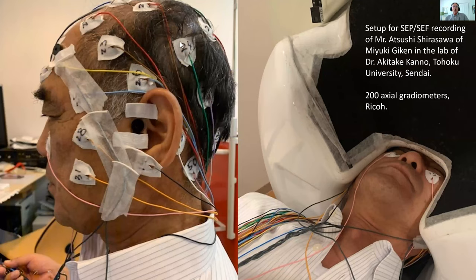Oh, okay. Are you talking about this one, for example? So here, in this lab, I do believe they're interested in epilepsy. So the MEG sensors are built into the helmet here, and there are 200 that cover the whole head. So that can be designed to cover as much brain activity as possible. EEG is a little different because notice with the MEG, you just put your head in the helmet. There's no physical contact. That's why MEG researchers get spoiled really easily.